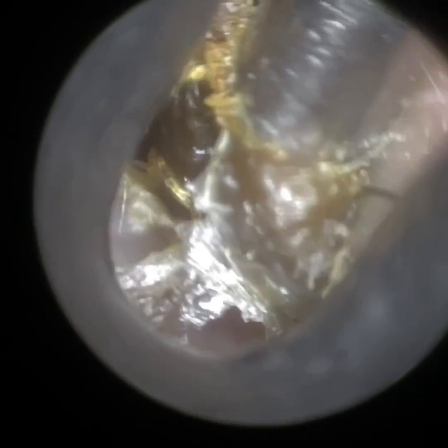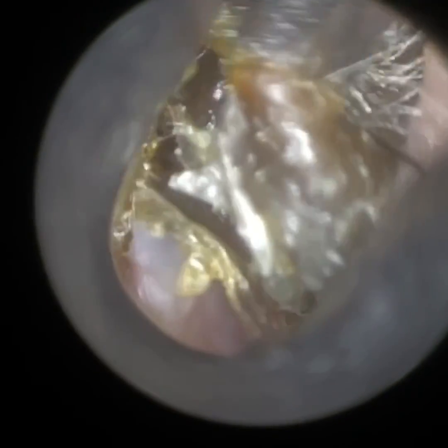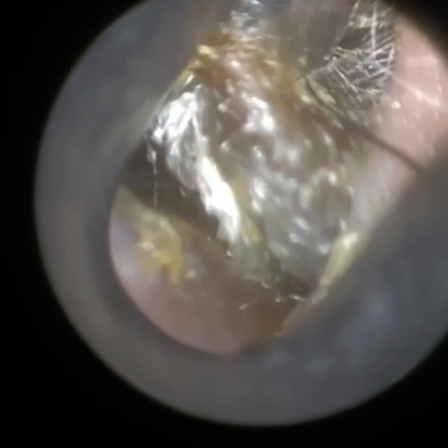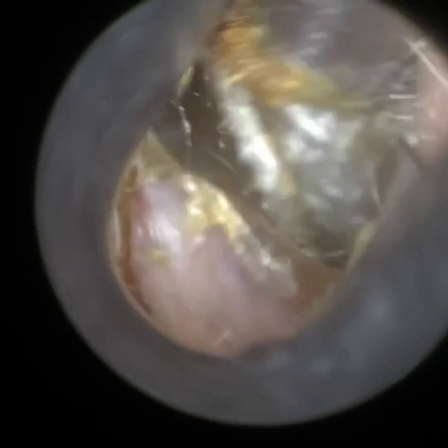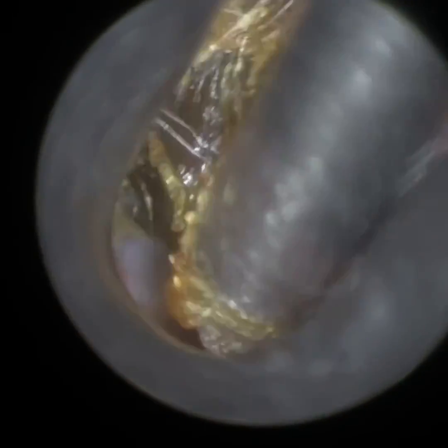Possibly these are the cases where some people would struggle with our flagship product, the iClearScope Endoscope. Once you've mastered the skill of using the iClearScope, in terms of view, there's nothing that can really compete with the view it provides. But some people do find it hard to use the iClearScope, and this is what led me to develop the Waxscope.